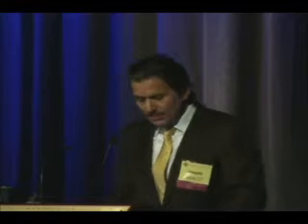This is from a paper that Chauhan and my group and Joost Jonas have collaborated on, looking at the comparison between measuring progression, looking at the optic nerve photographs compared with sequential HRT analyses using the TCA analysis. On the left, we see an example in which all the observers agree that there was clear evidence of progression of disc change that you can see there quite clearly. And over this period of time, there have been a number of serial HRT images, and one can see that the TCA also picks up this change.